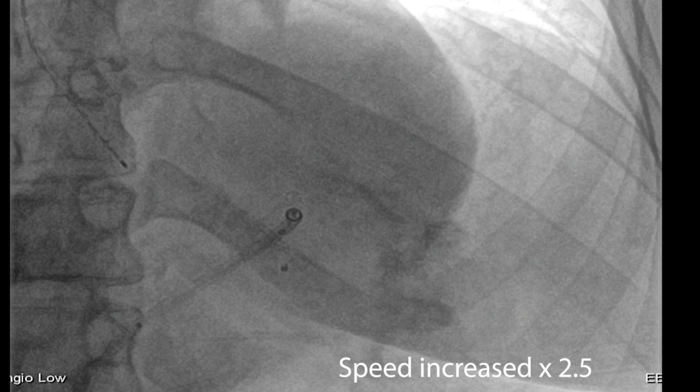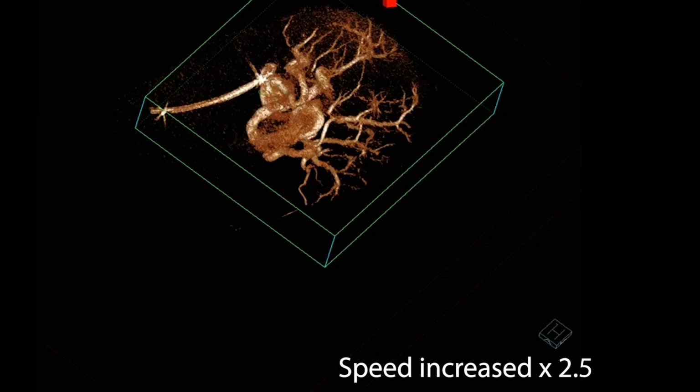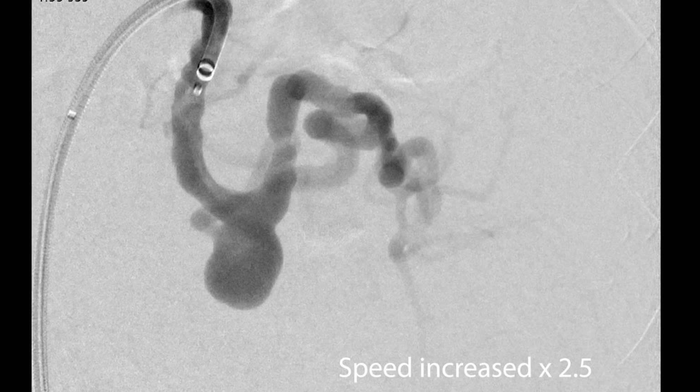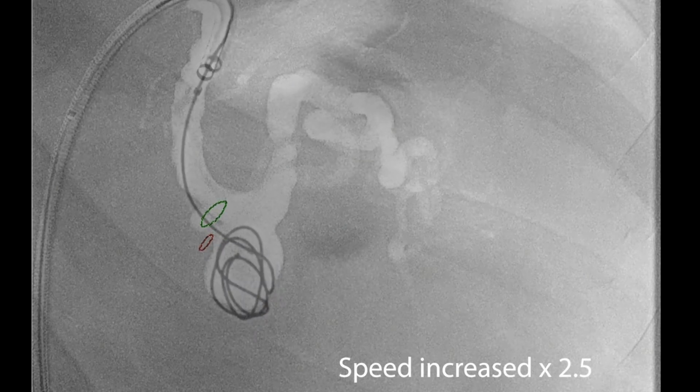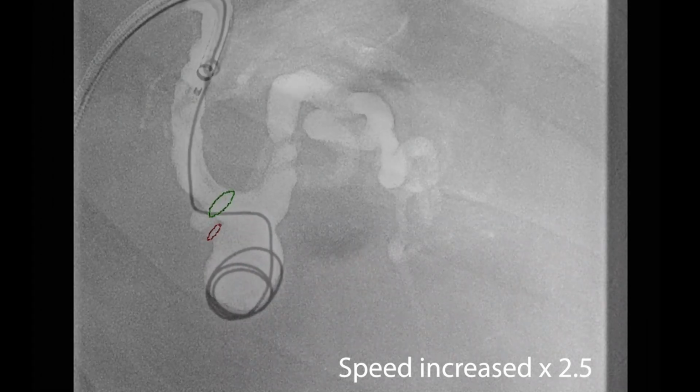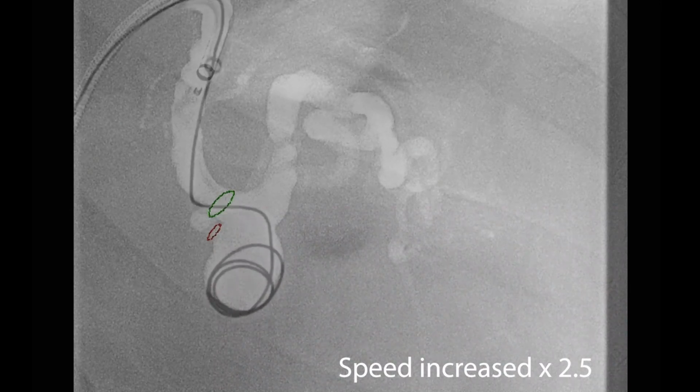Optimizing the imaging here by bringing in the filters. We're always going backwards and forwards looking at the CT scan or cone beam CT scan. Now you can see how we've laid out the smaller branch. We've marked that out on the CT scan as red. The inflow is green, and we'll show what the outflow actually is also.